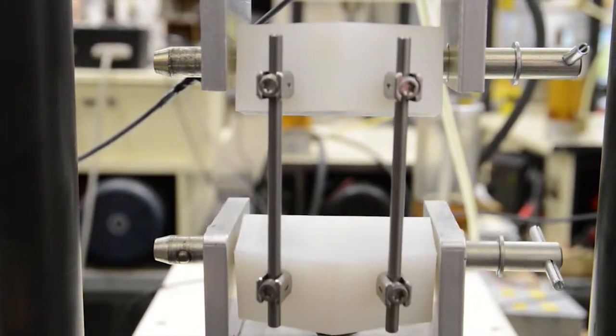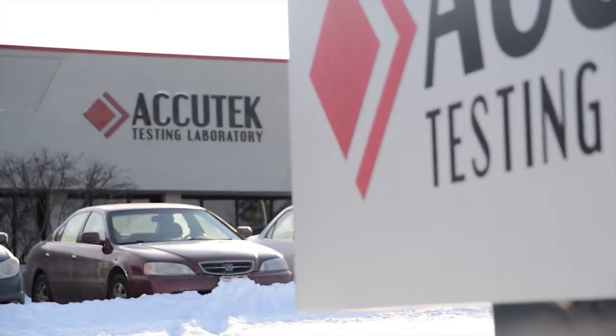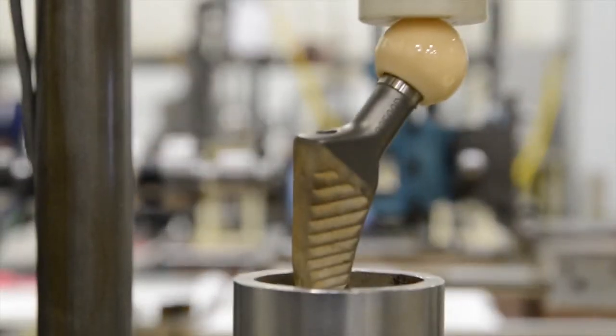We do all kinds of medical device testing at Accutek, pretty much head to toe. We do mechanical testing on implants, and one way that we do that quickly is we have a number of test frames here so we can cut down on lead times and get your project in house. When we get parts, we're already set up so we can put your parts into the test frame and get tests started quickly.